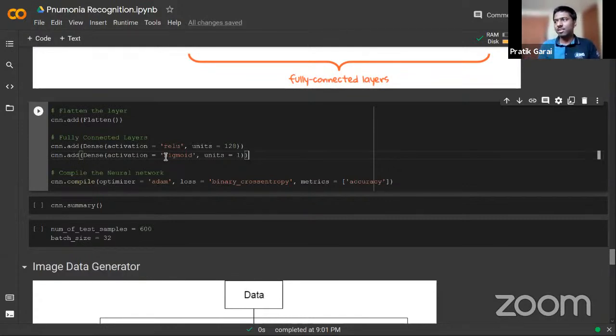0 means that person is completely normal. 1 means a person has completely pneumonia, like there is 100% confidence. The machine learning model is saying I am 100% confident that this is a pneumonic lung. In most cases, it does not do that. In most cases, it will give you a confidence value, like I am 60% sure that maybe this person has pneumonia, or maybe I'm 30% sure that this person has pneumonia. It will pass out something like that.